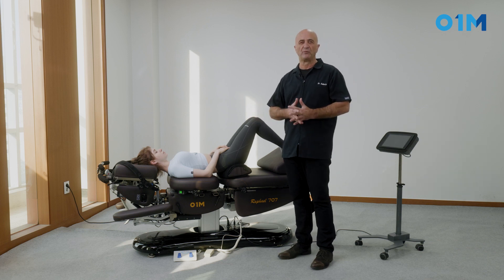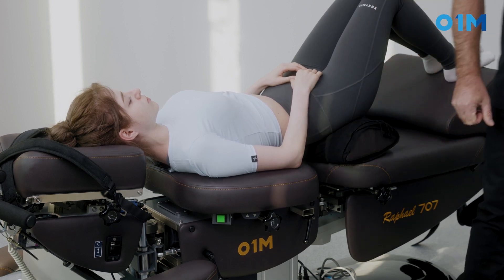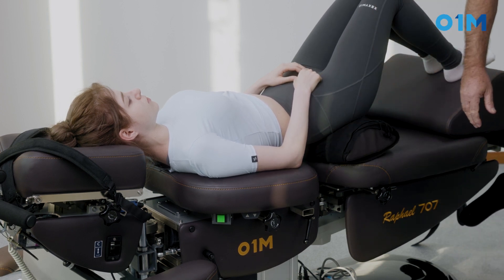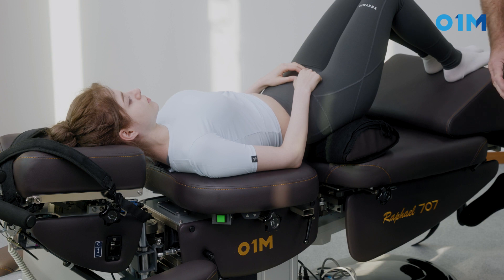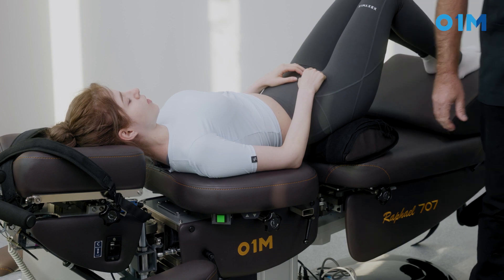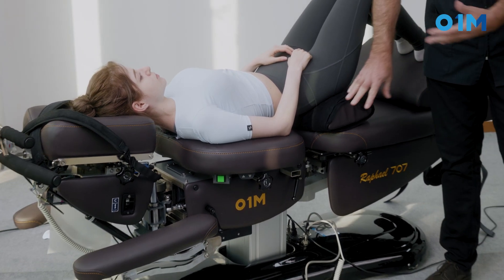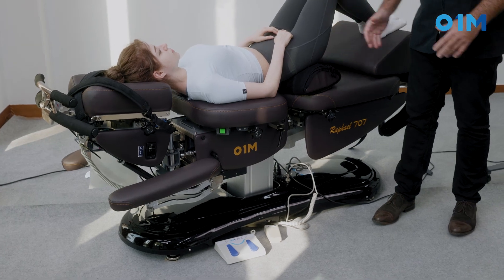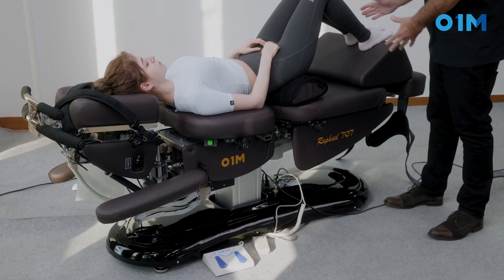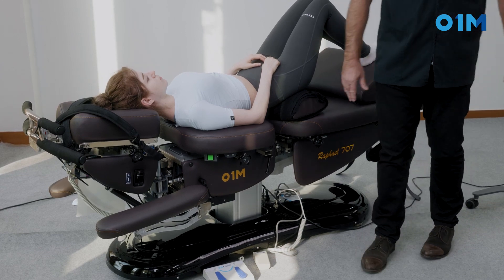So what type of equipment do we need? We need a table with a firm cover — you cannot have a table too mushy. You need the ability of that table to have a drop, and here we have a drop. We also need a big square foam for the patient's feet so the leg will be at 90 degrees.